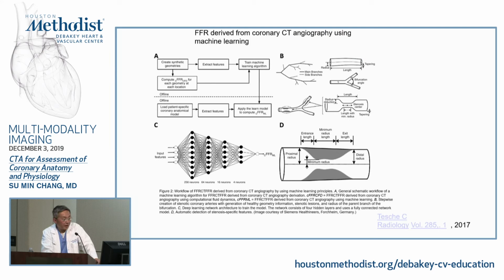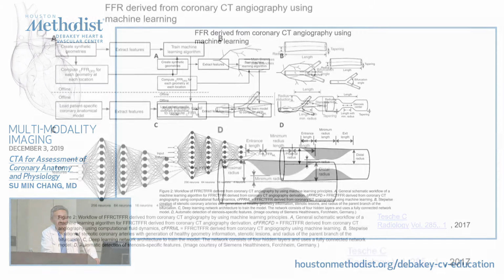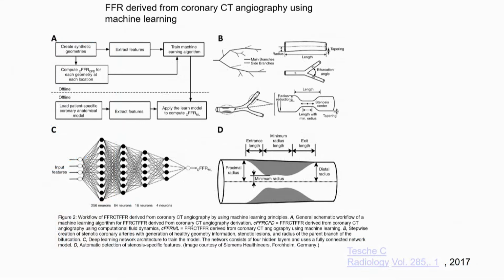It's been approved by FDA, but the other way of doing it is called machine learning. This is a little bit different. They essentially construct the algorithm not using patient data, but rather using models of a phantom, with different diameters of the tube, modeling different stenoses.